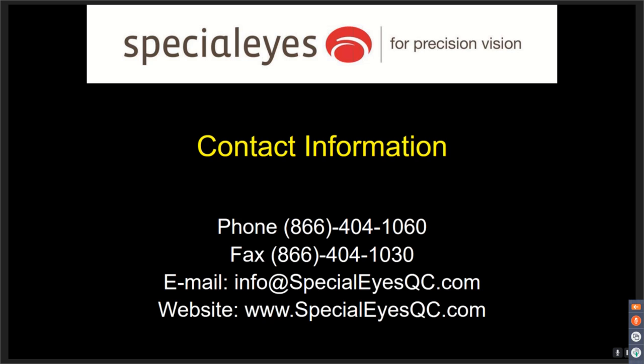And then I'll chime in a little bit there on Adam at the end of that question. What I'd really like to reiterate is we've seen from a consultative perspective, it really hinges on solid information up front. That 1 to 2 trial lenses to success means a solid refraction, a good fit, and then accurate pupil size upon initial design of the first trial lenses. As we've seen from the presentation, the design is very hinged upon correct and accurate pupil size measurement.